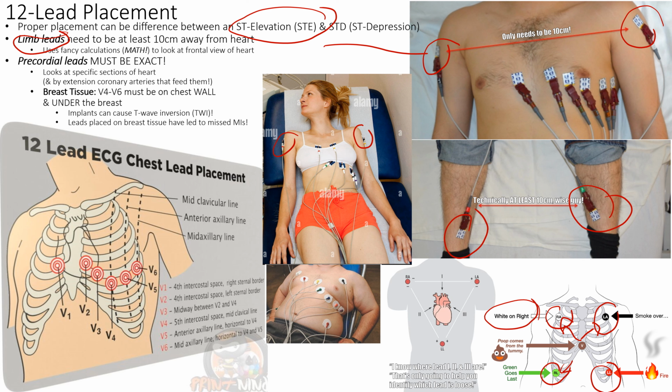That is where you know that you are above the green lead as well. And our green lead is usually the lead that is for grounding the EKG. So if you see a lot of interference, it's usually the green lead that is loose. Okay. So yeah, limb leads are going to be assessing a frontal view of the heart. It's going to slice the heart in half. So if you were to peel someone open and cut them in half, it's getting serial killery. But anyways, you're going to be able to see the cross section of the heart, and the inferior portion or the lateral portion is usually what we're looking at.